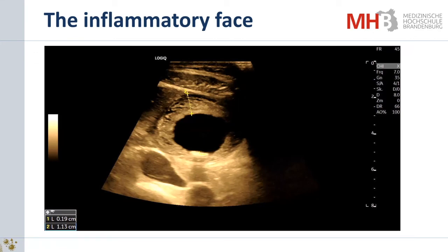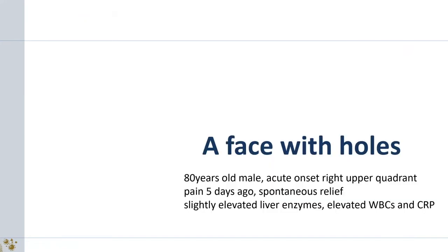I may show you an example of some perforation. But in some cases, it is not to be decided. But in most cases of severe cholecystitis, you have only a little amount of free fluid only around the gallbladder. Yes, this is this phase of gallbladder with holes.